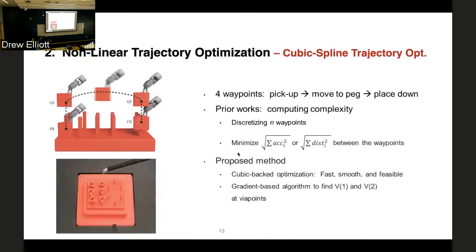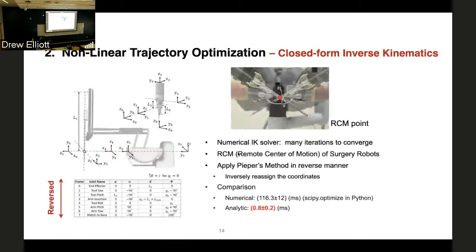So with that, we started to look at whether we could perform this task autonomously. Once Minho had this calibrated, we were able to actually reach desired points fairly accurately. Using the RGBD sensing, you can see that it's able to determine where the pegs are and the blocks on each peg, and that allows you to define a desired grip point, and then how to do these transfers. He also wanted to optimize the entire motion, as you can see here, and we'll say more about this in a minute.